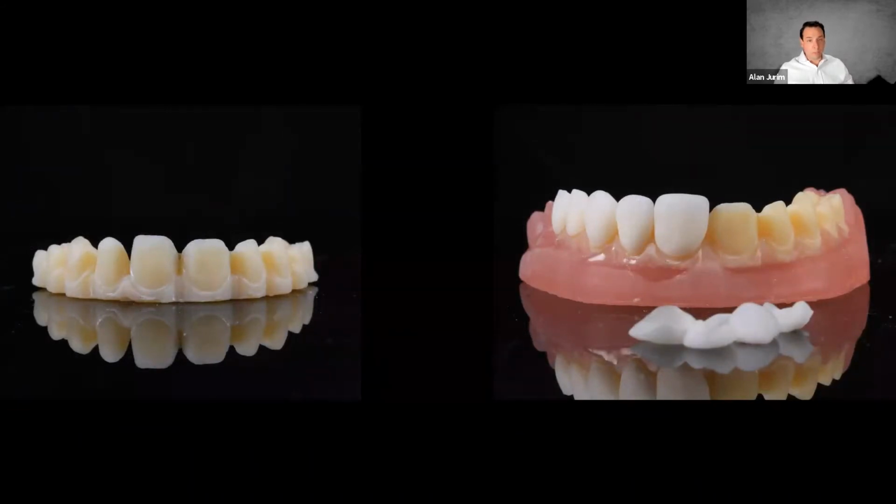And then we printed the rest of the model in pink, so that when we presented it to the patient, we had a better time. We didn't have the patient saying, why do they look so dark? But fundamentally, we're going to use these models as a way for the technician to have a placeholder if they're going to build up porcelain.